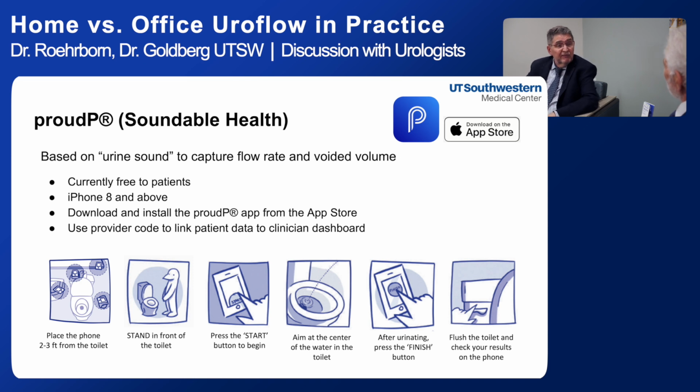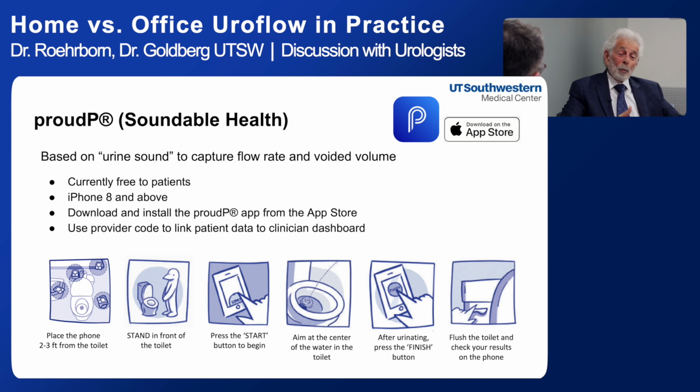The patient sits down for dinner, and he says, well, honey, I got to go urinate. Takes his iPhone, he marches in there, and then what does he do? He opens the app, gets it ready, simply says ready, hits the button, gets a 3-second countdown, and can start to go. And once he's completed going, he just presses stop, and that's it.